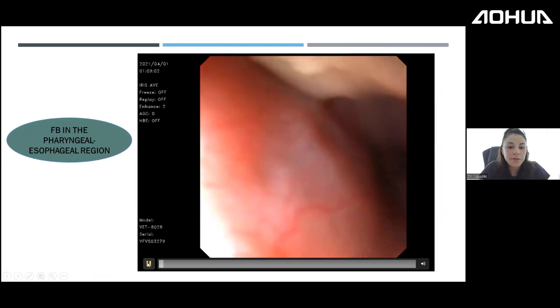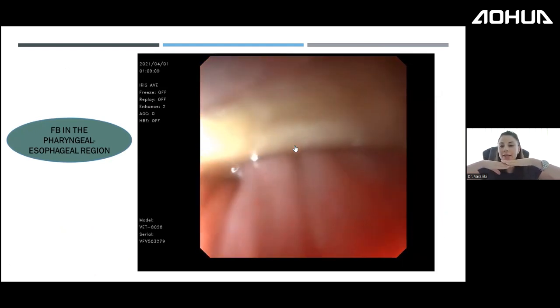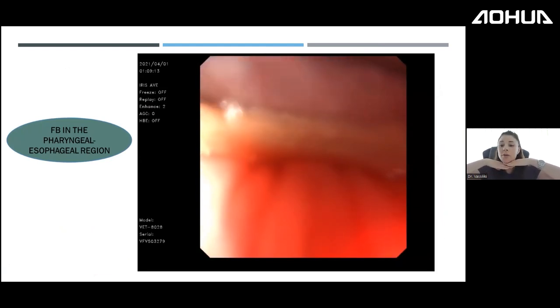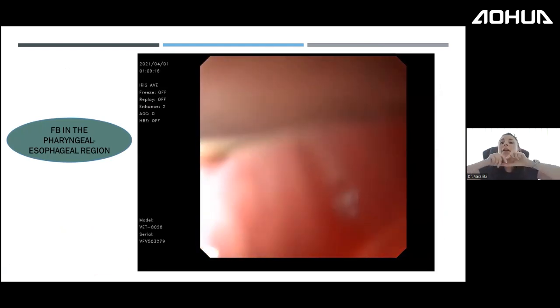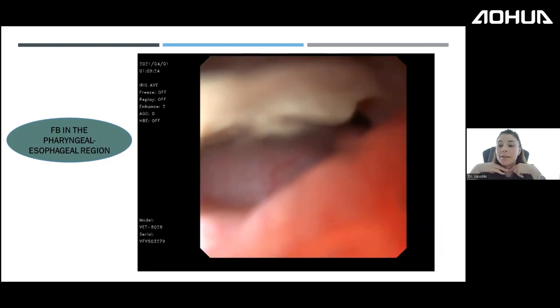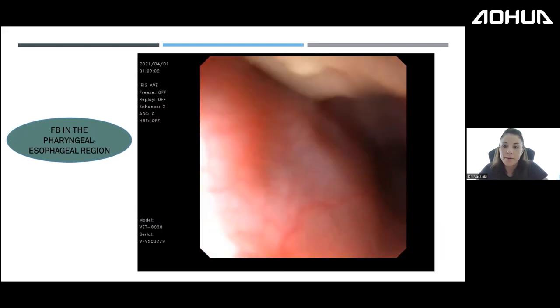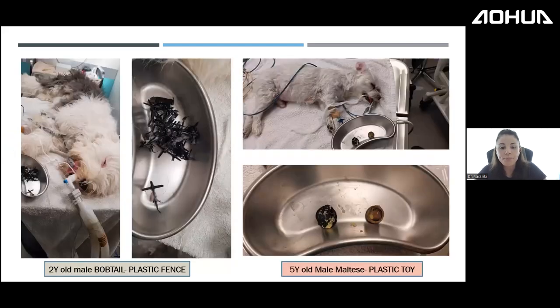Looking at the dog admitted as a cardiology case, here you can see a bone sitting horizontally in the pharyngeal region. The bone was obstructing the airways, which explains the cyanotic tongue and labored breathing. That was a relatively easy foreign body to remove.